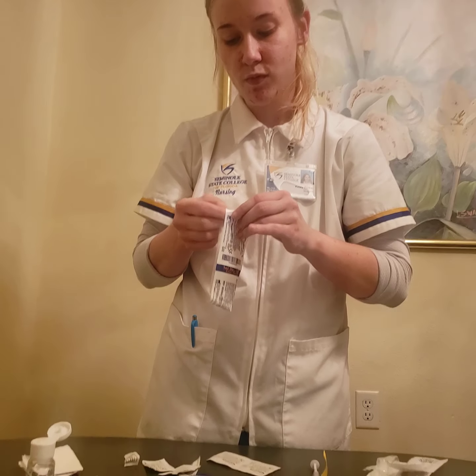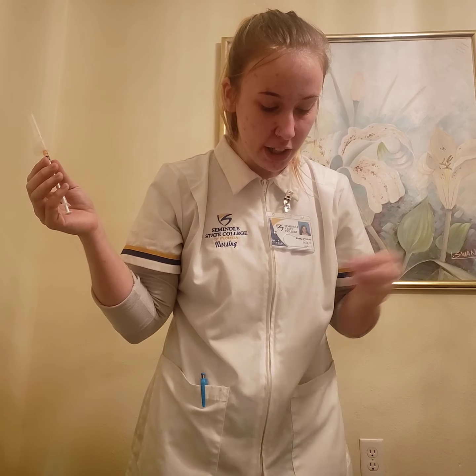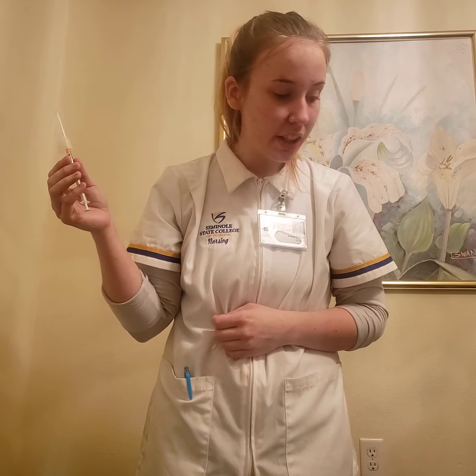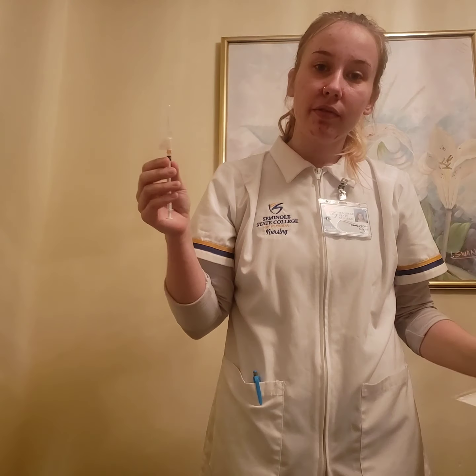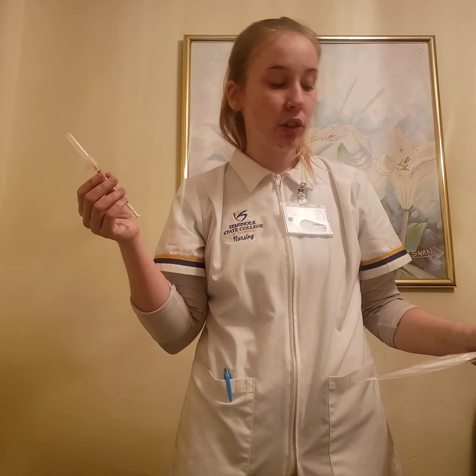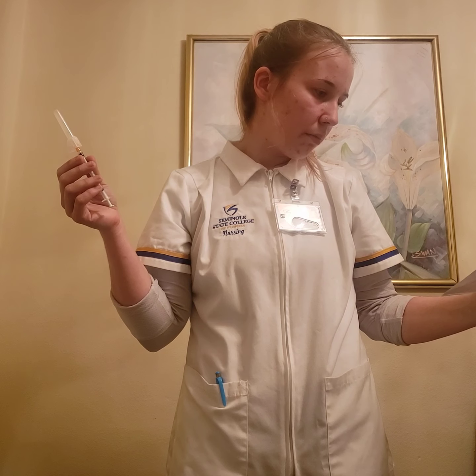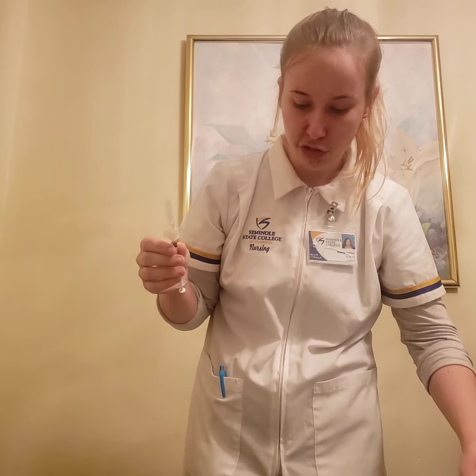Alright, same thing with this. We're going to make sure the ends of our luer locks stay completely clean. Okay, for this one I know I'm going to be giving Miss Anna Pawlowski 0.5 milliliters of the B12 injection, which equals 500 micrograms. I'm going to be giving it today at 1300 in the subcutaneous injection route. Okay, that is my first check.